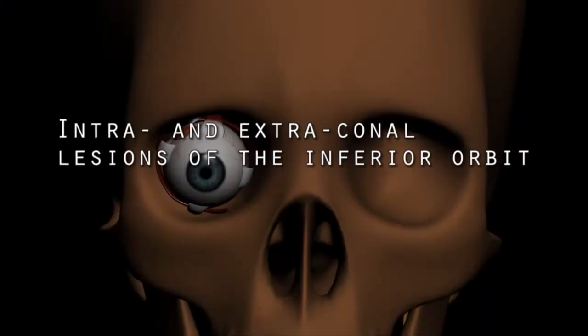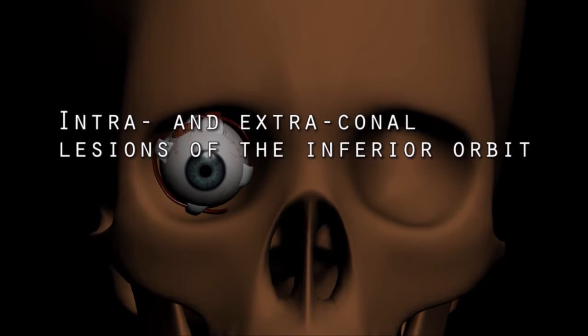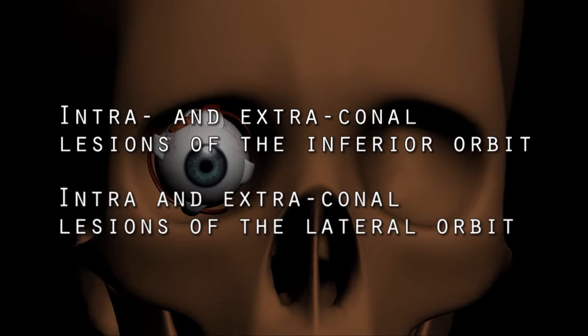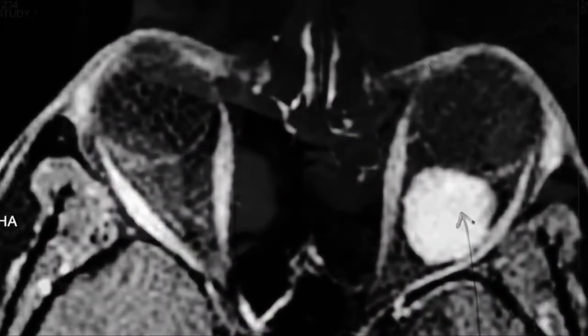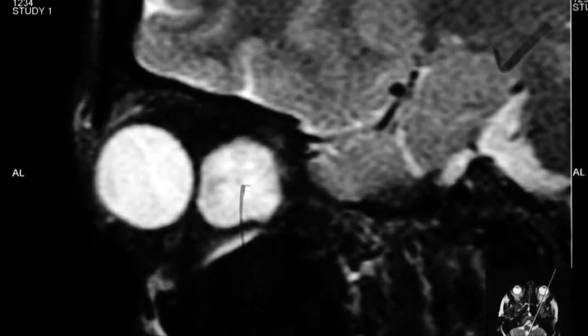Hence, it may be used for intra- and extraconal lesions of the inferior orbit, and intra- and extraconal lesions of the lateral orbit. This video incorporates an orbitotomy surgery by the inferior forniceal conjunctival approach for an intraconal cavernous hemangioma in the left orbit in a 39-year-old patient.